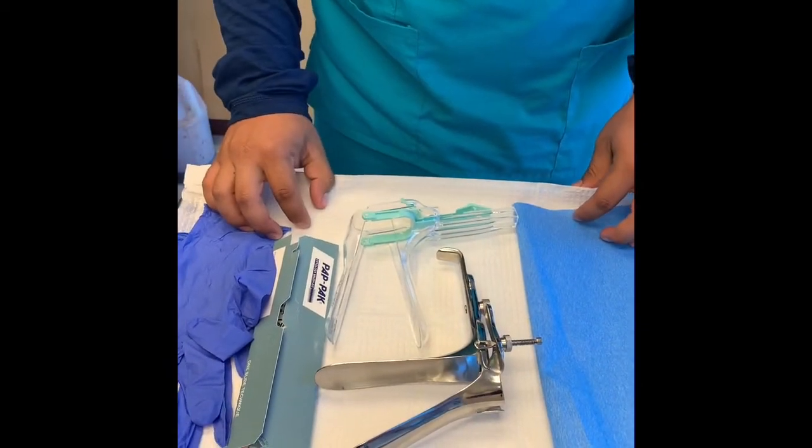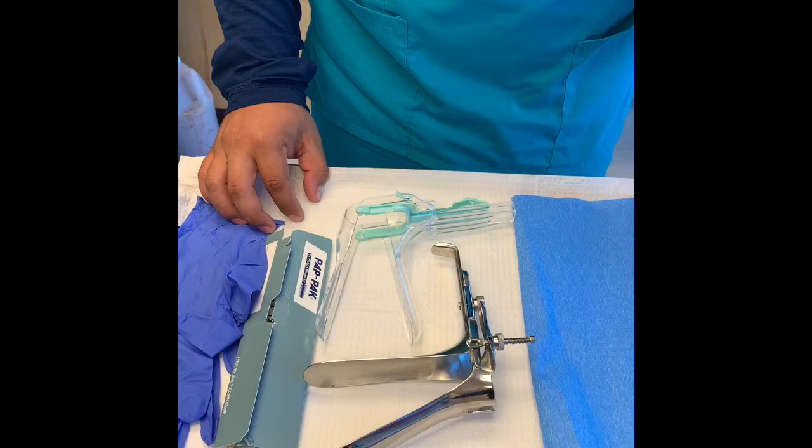Okay, and this is all you need for a gynecological exam, also known as a pap smear.